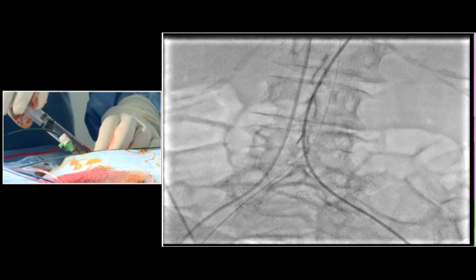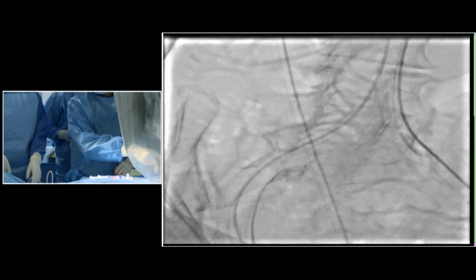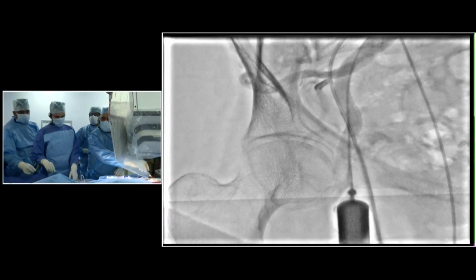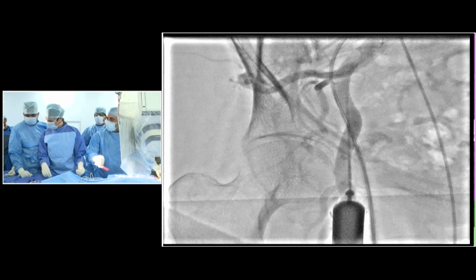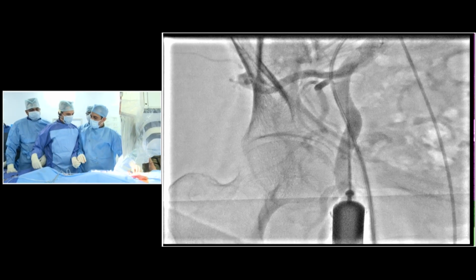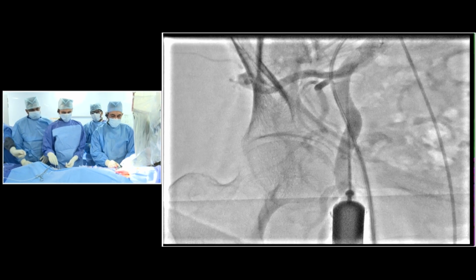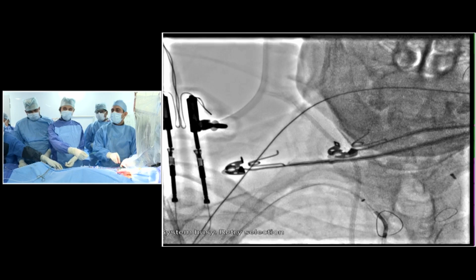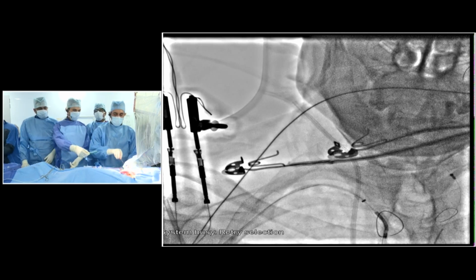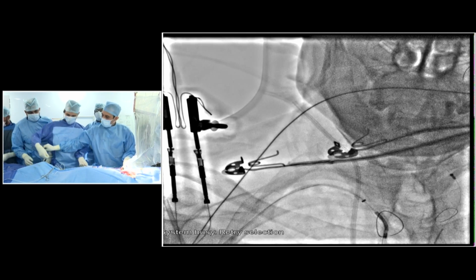And obviously the experience with the commissural alignment in this country is quite substantial. As a matter of fact, there is a publication, a paper submitted, about 35 cases with multi-slice CT scan pre and post.